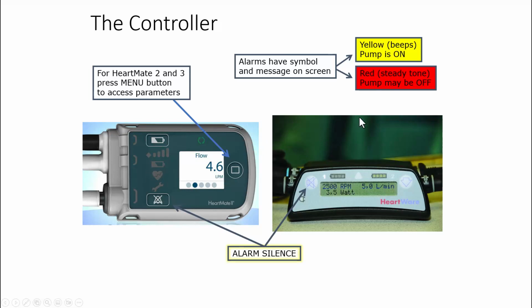Now, as a general rule, if it's yellow or green, the pump is running. If it's red, the pump is not running, and red is bad.